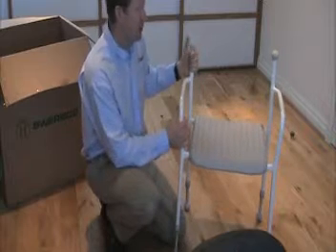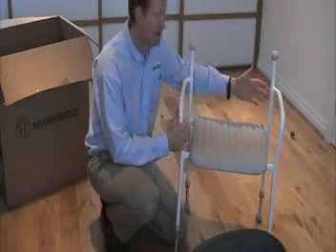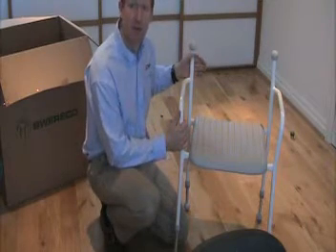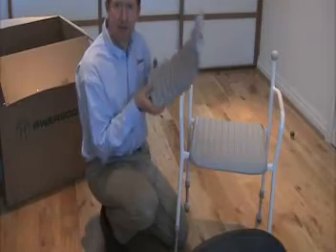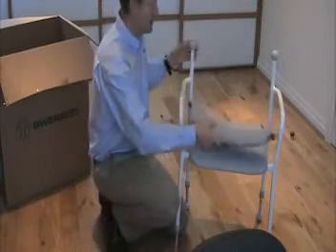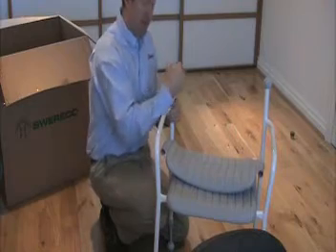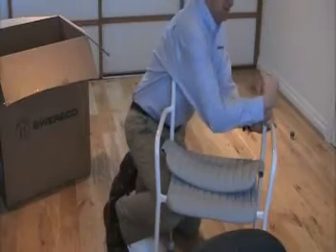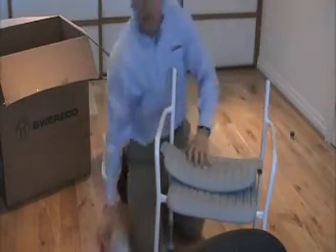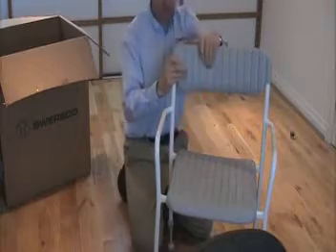On this one, we have the backrest. The backrest is an option. You can have the material backrest or the plastic backrest such as this. To put the backrest on, just take off the rubber stops at the top and then place the backrest on like that.